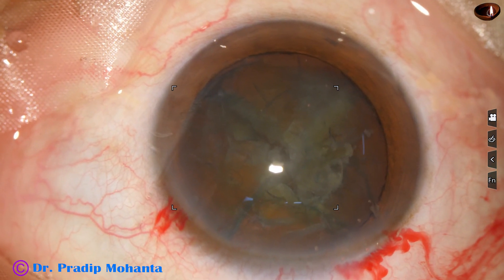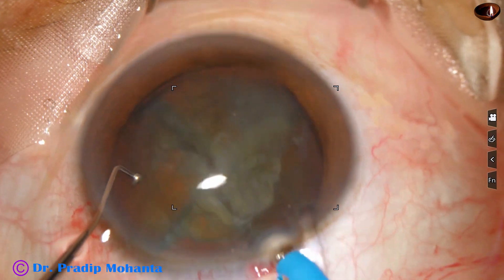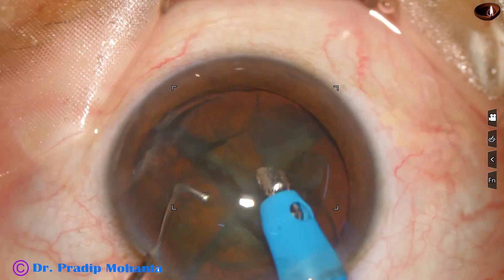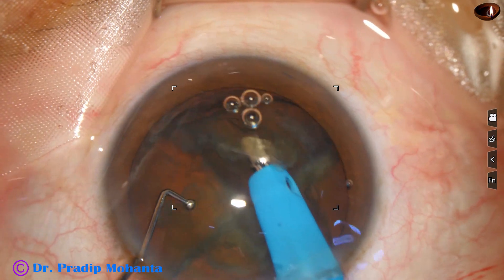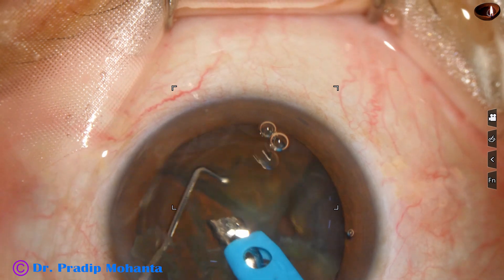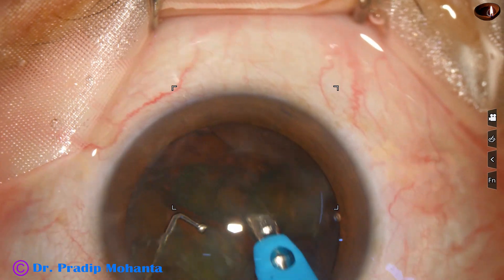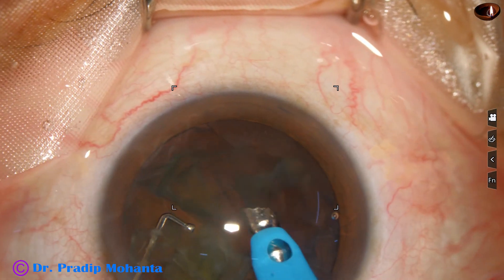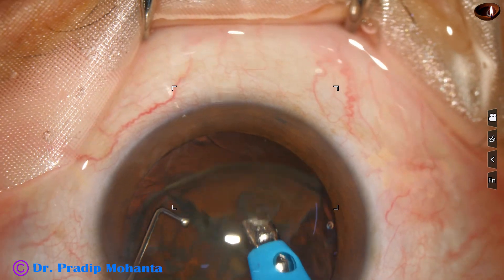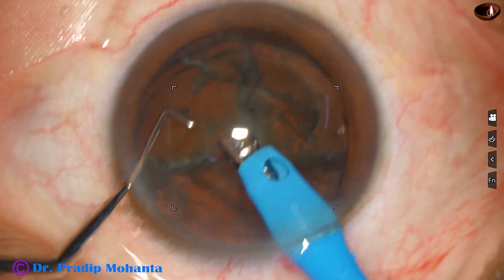Once we get four nuclear fragments, it is very easy to pick up the pieces and emulsify them. The phaco needle is introduced, the pieces are tilted, and emulsification is started from the apex. Two pieces have been emulsified. Ultrasonic energy used is 50%, vacuum is 450 mmHg, and flow rate is 45 ml per minute.